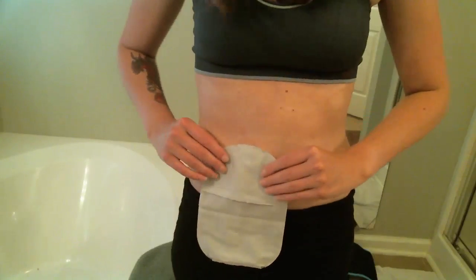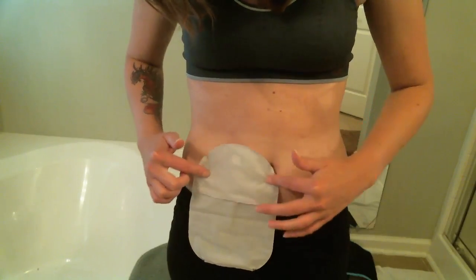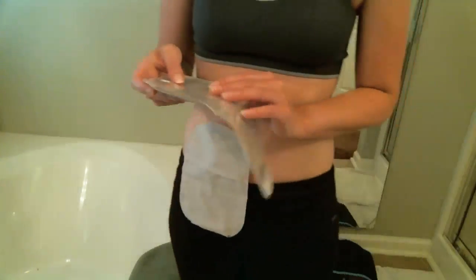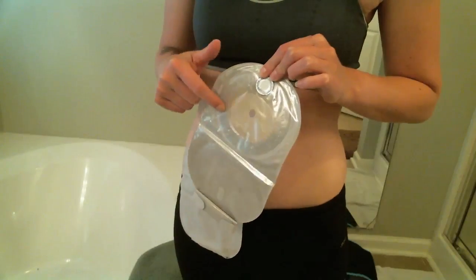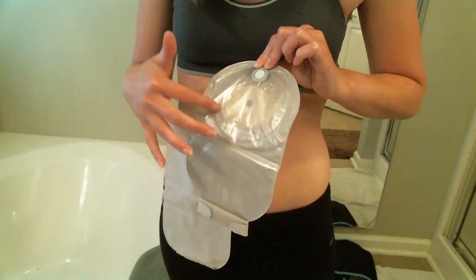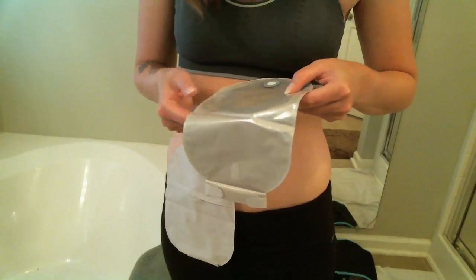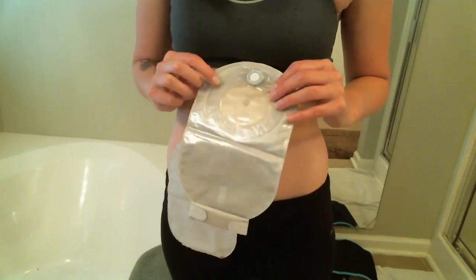But one thing that I am not entirely sure about is it has a really large filter here. And actually, I have another one. They also sent me a clear bag, so you can see on this one that there is this really large filter that goes all the way around. At this point, I'm still going to be interested to see how it works. I am a little nervous about things getting caught in that and causing issues that way.